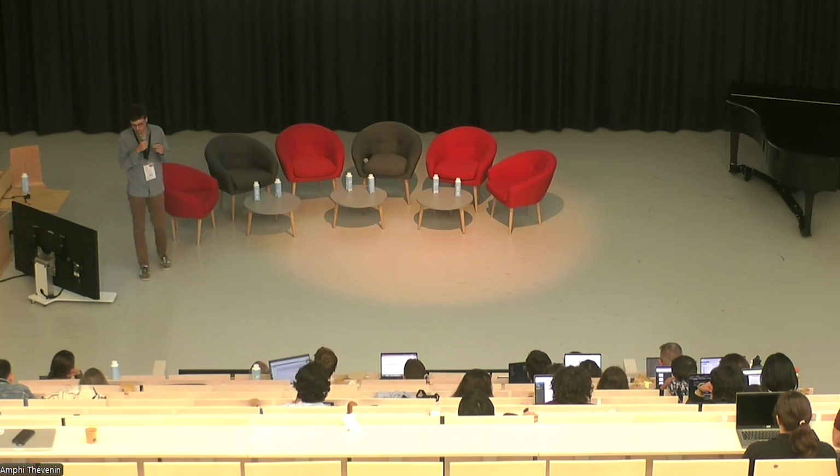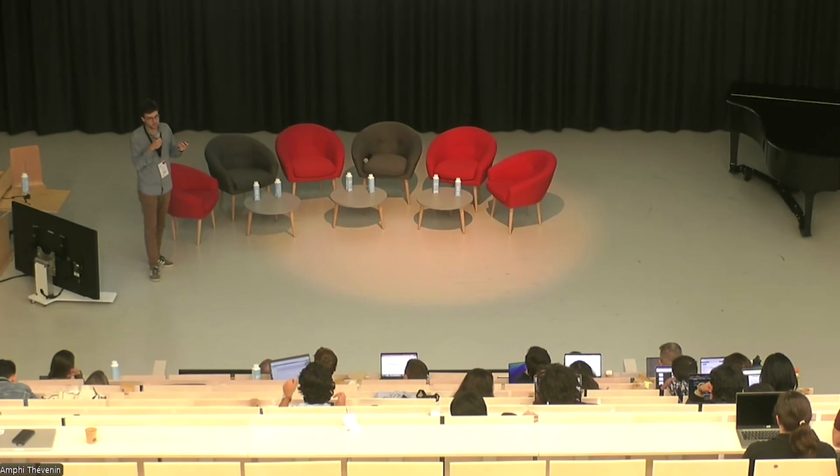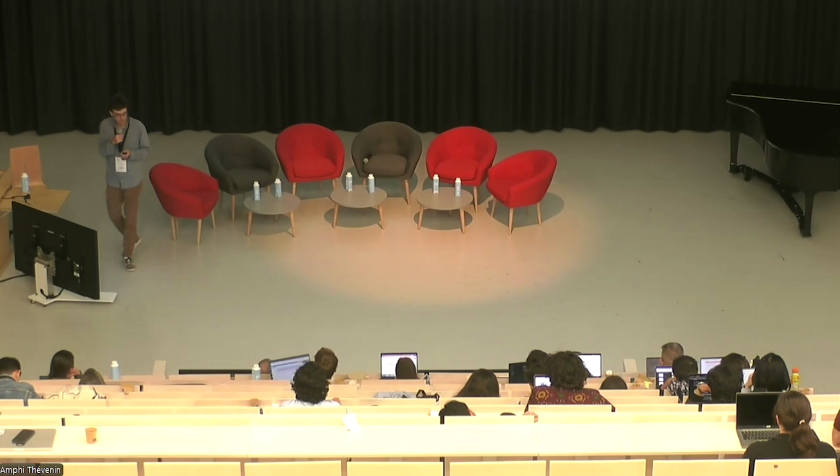During the training, we force the masking to happen inside the body and not in the air, so the task is not trivial and it's not just predicting some dark pixels. And yeah, it beats Curia 1 on the public benchmark, CuriaBench, that we released.